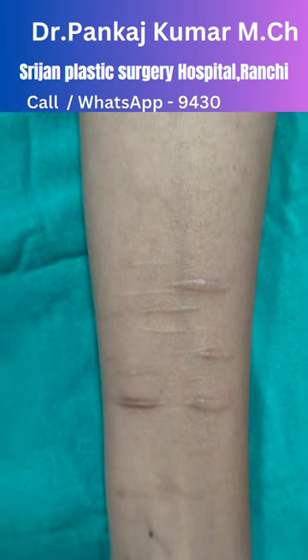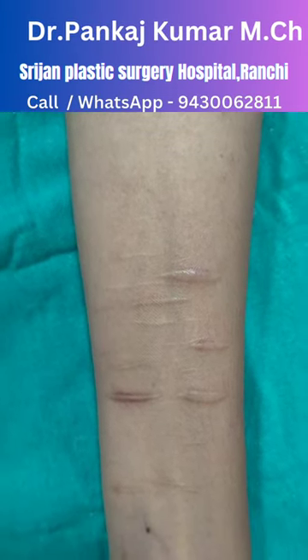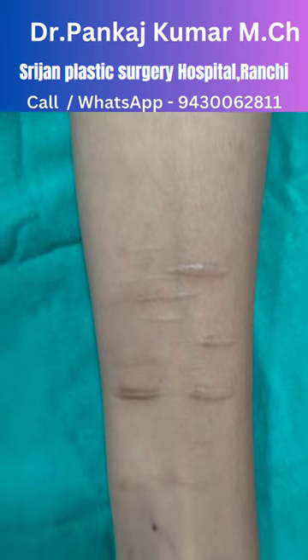In this condition, we can see multiple cut marks on the forearm. These are also called hesitation marks.